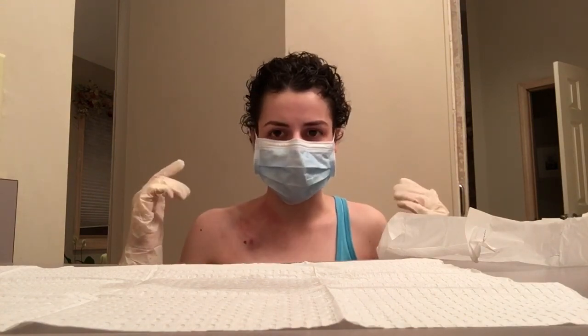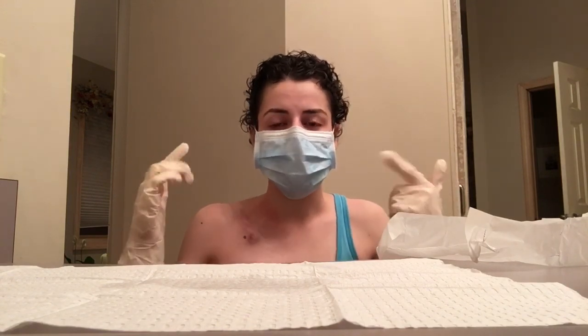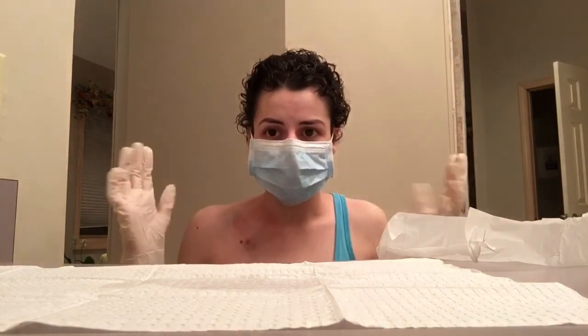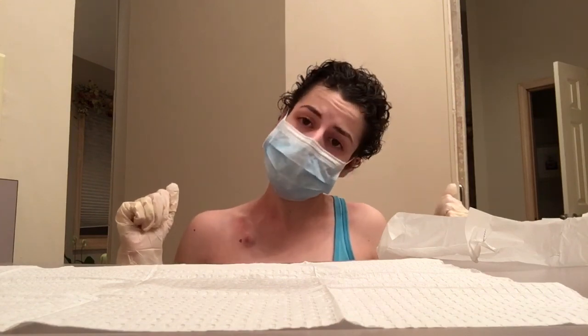Also, one thing to remember if you're accessing your own port is I'm making this kind of face under here because I'm pulling my mask down a little because it's getting my eyes. This I put on with my hands, which you're supposed to do. So that means I can't touch it with my sterile gloves. So if it kind of moves, you kind of gotta fix it yourself.